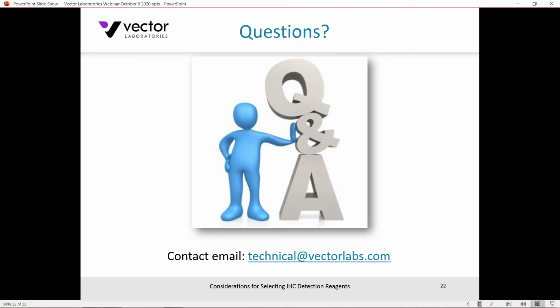Indeed, in the presentation earlier on, I did show an example of 2 HRP substrates. I believe it was DAB and Vector VIP. They were actually performed using 2 mouse monoclonals, if I remember correctly. So it just gives you a bit of an idea, and they were in very close apposition to each other. So yeah, certainly sequential labeling would be recommended.